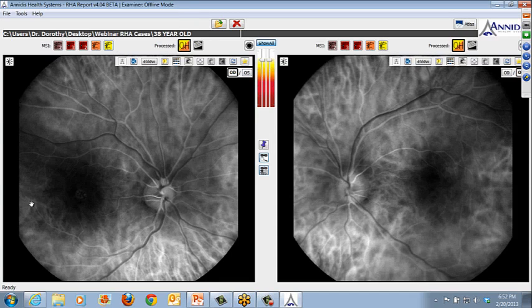His oxygen map, you can see again, there's missing RPE pigment, which allows you to view straight through to the choroid. So this is somewhat akin to choroidal flush. If you have atrophy on IV fluorescein, this does not represent a neovascular membrane here. It just represents the oxygenated blood that you can see from the choroid through the RPE because of the atrophy.